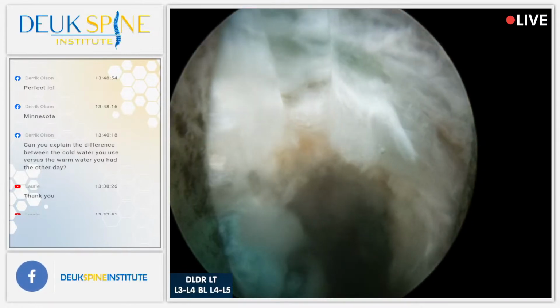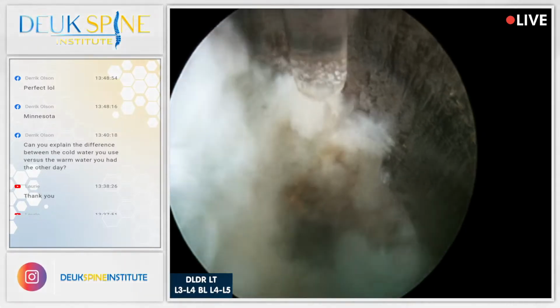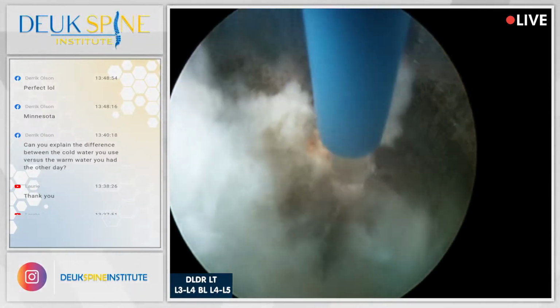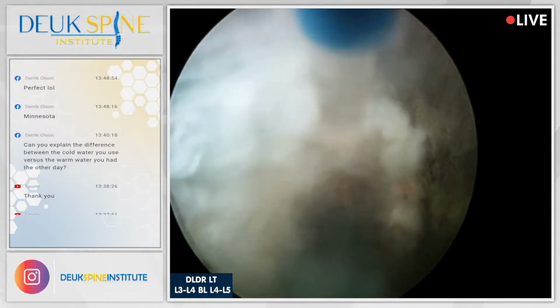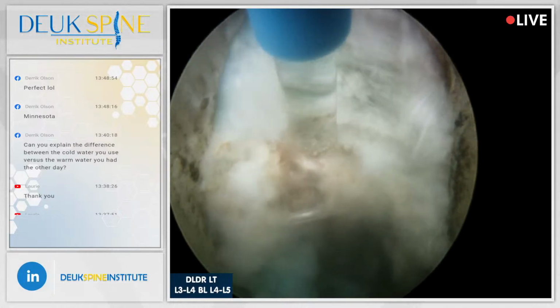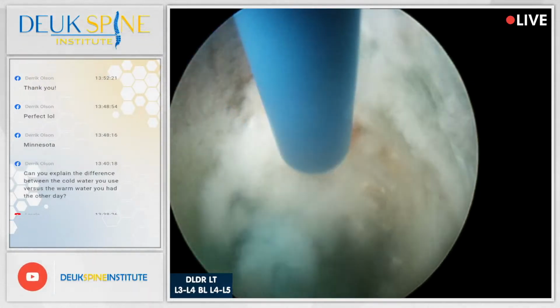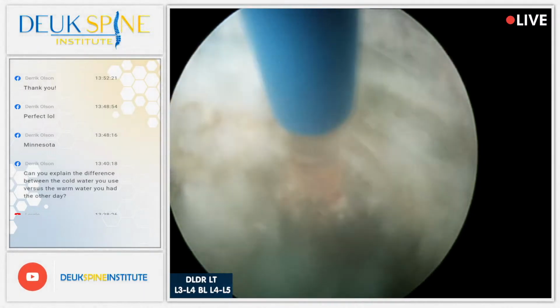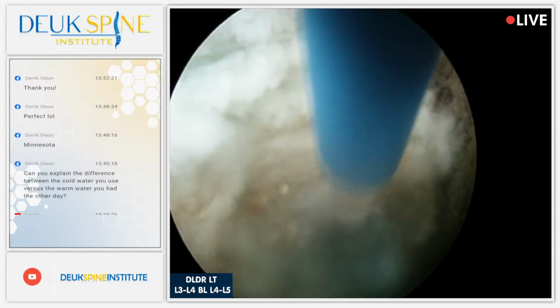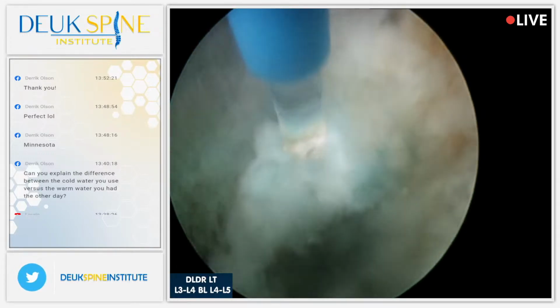This is the outside of the bulge right here. And what makes up the bulge is the herniation within the tear. So it's not the tear that is a bulge, it's the herniation in the tear that's the bulge. And the herniation behind the tear that's the bulge. But that was the bulge. The bulge is now gone. Okay? And this is still a herniated disc right here.